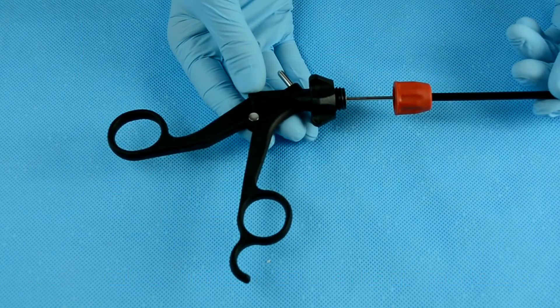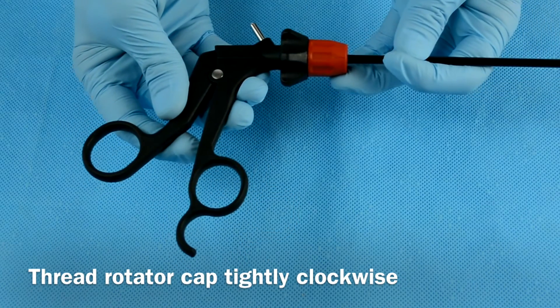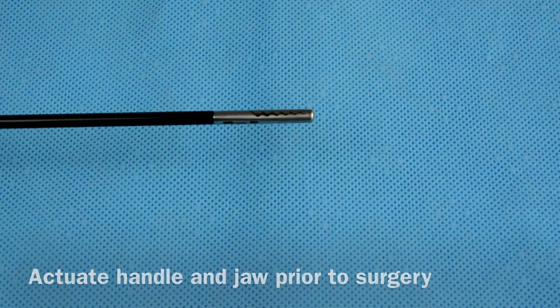Once the jaw and the handle close at the same time, the shaft is secured. Thread the rotator cap clockwise and confirm assembly by opening and closing the jaw with the handle. Lastly, make sure to actuate the handle and jaw prior to surgery.